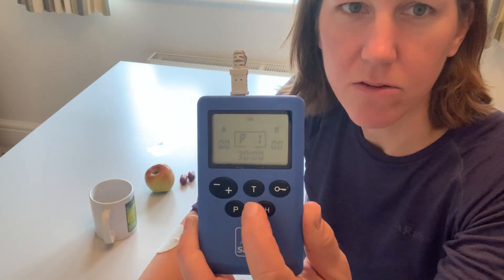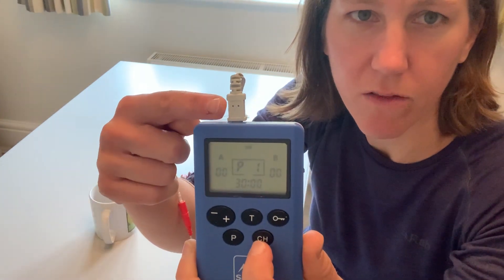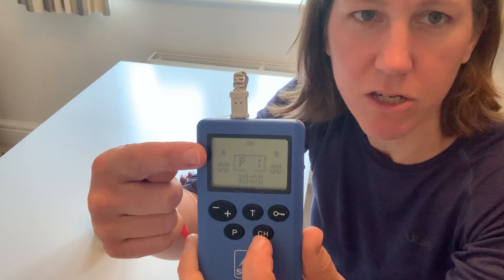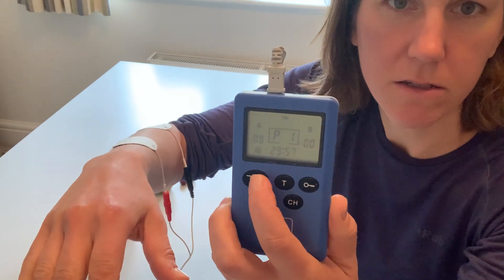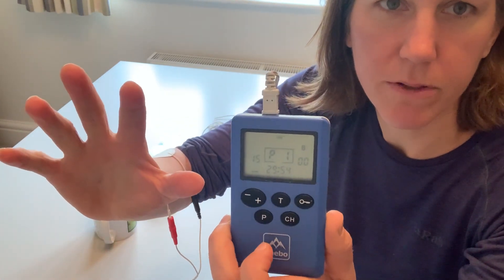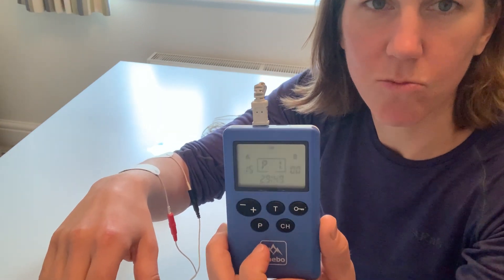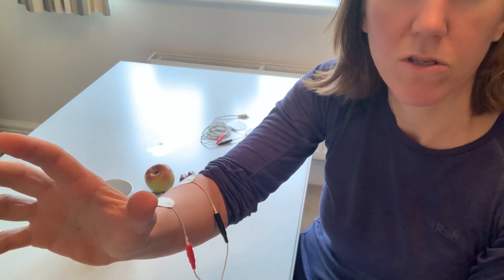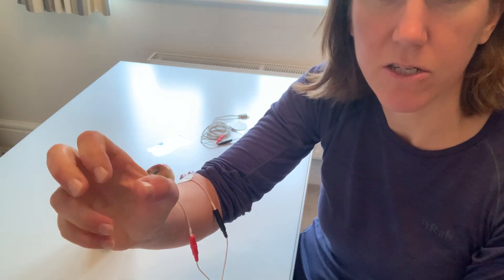Once I press go, I select the channel by making channel A flash — the one I've got the lead in — and I turn it up and the stimulation starts. There we go, there's my hand opening up. In the standard setup I need to work with the timing, so I've got to wait until the stimulation comes on to grasp the object. Once it switches off I can close around it, then wait for the stimulation to come back on to be able to let go.